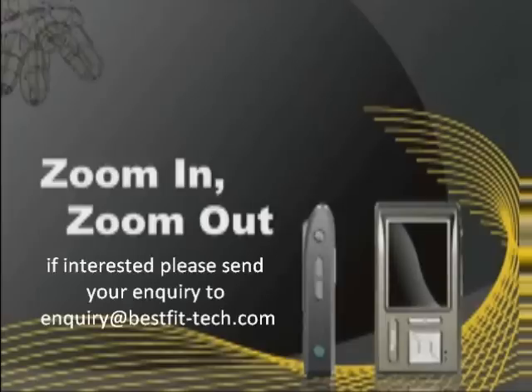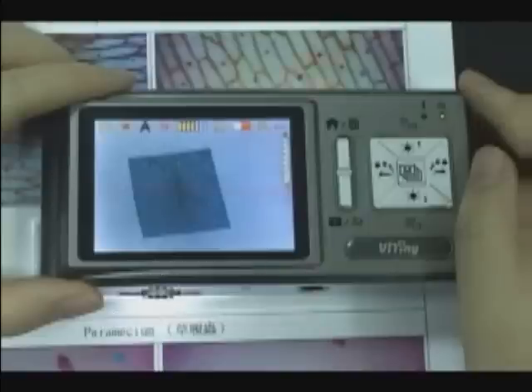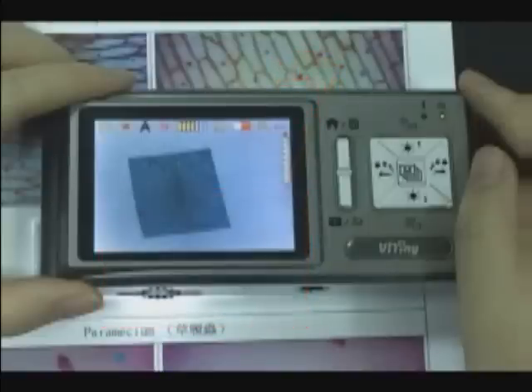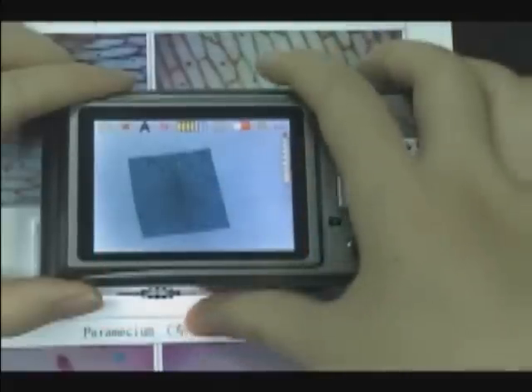Zoom in and out. Press the zoom in and zoom out buttons to adjust image size.